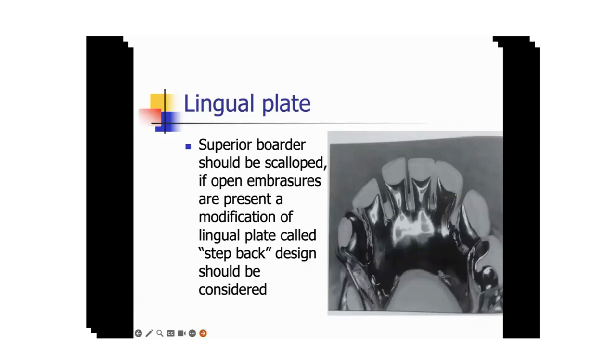You can see the gap between the teeth. If there are open embrasures between your patient's teeth, then your superior border should be scalloped. And this particular modification of the lingual plate is called a step back design.